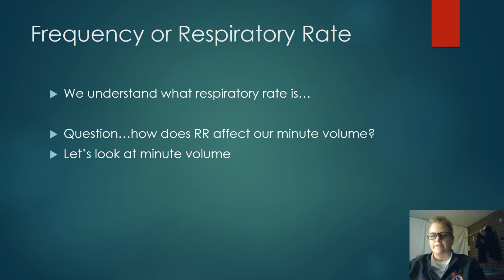They're trying to blow off the excess acid and CO2 out of their systems. Those patients are not going to do well with a respiratory rate of 18 or 20. We have to, on those patients, double that respiratory rate because we have to keep them as close to their physiological compensation as we can. And so we might see those patients with a tidal volume of 480 and a respiratory rate of 36 or 40. And we have to do that with those DKA patients and with those aspirin overdose patients, those patients that are in serious metabolic acidosis. Okay?